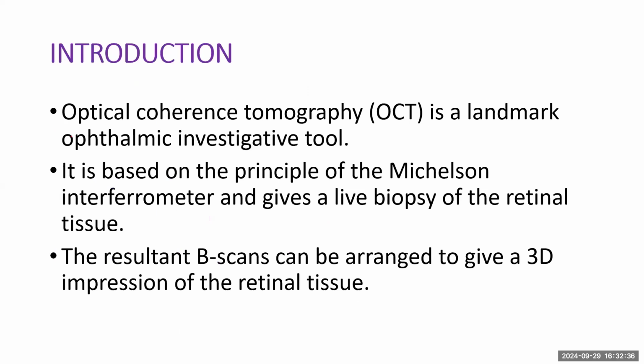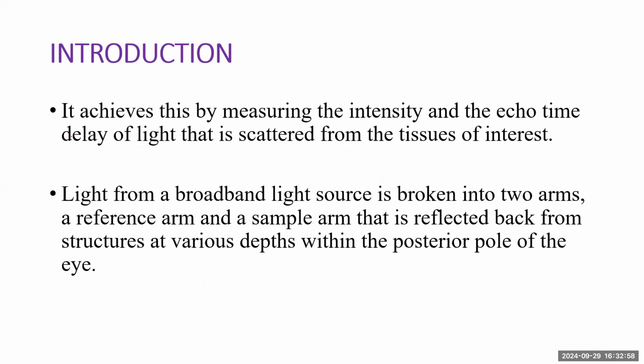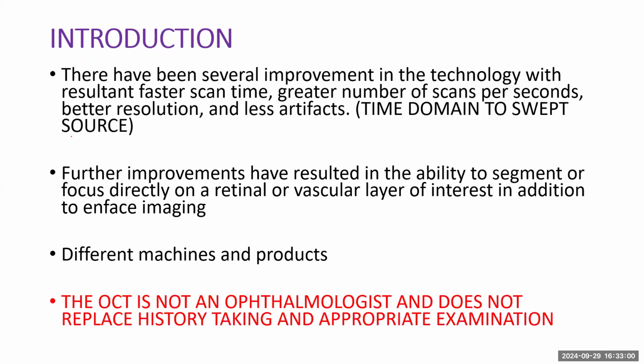Some time ago, I had the privilege of discussing the OCT retina. I included this for those who were not part of that discussion, introducing the OCT as a landmark ophthalmic investigative tool, giving a live biopsy of whatever ocular tissue, based on the interferometer principle.